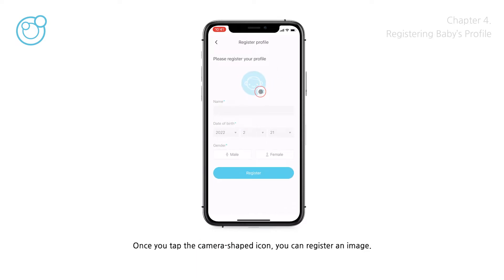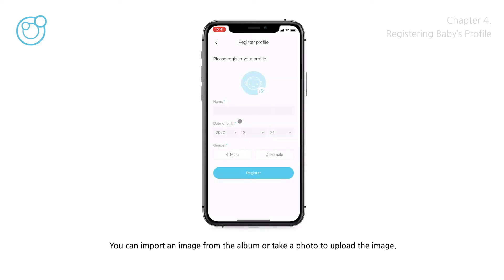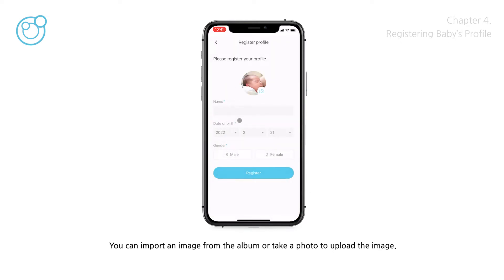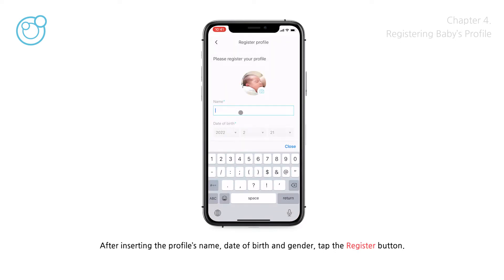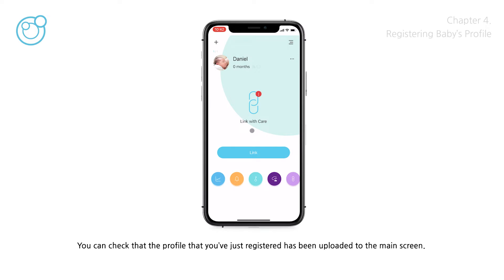Once you tap the camera-shaped icon, you can register an image. You can import an image from the album or take a photo to upload. After inserting the profile's name, date of birth, and gender, tap the Register button. Then you can check that the profile you've just registered has been uploaded to the main screen.